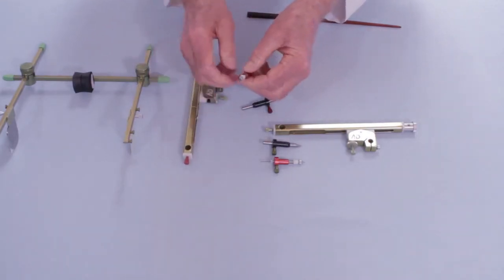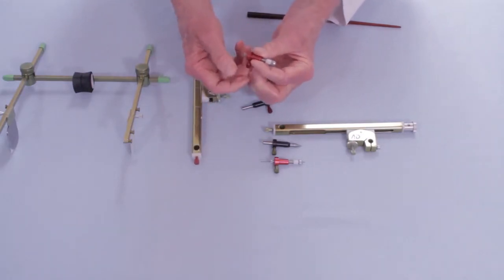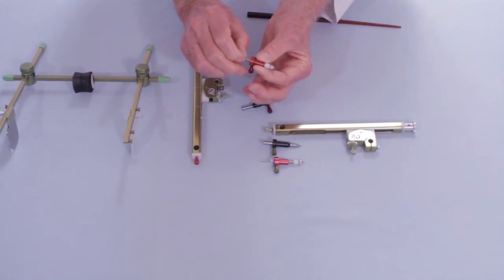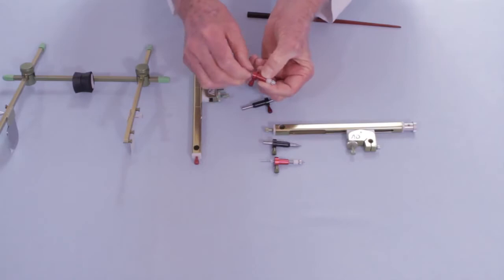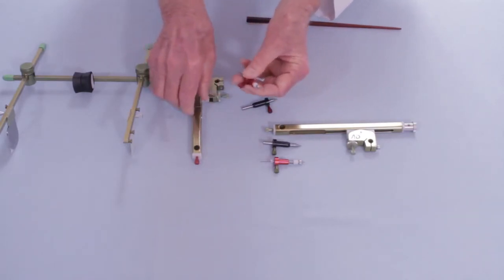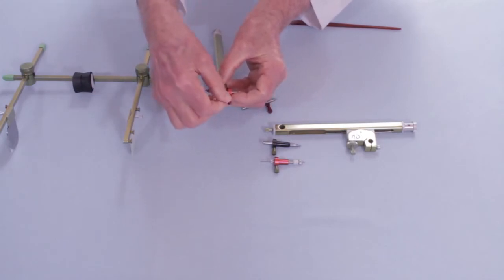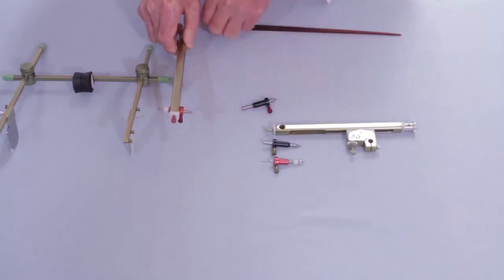And then when we get ready to put the writing pencil on the patient, we want to pull the writing pencil back. It's spring-loaded. You loosen it, you pull it back like so. Pull it back and lock it so that the writing pencil then can be inserted into the sidearm. The distance has been set.